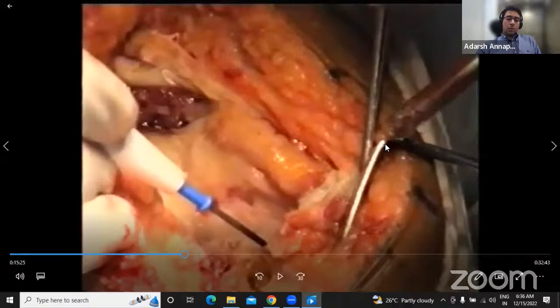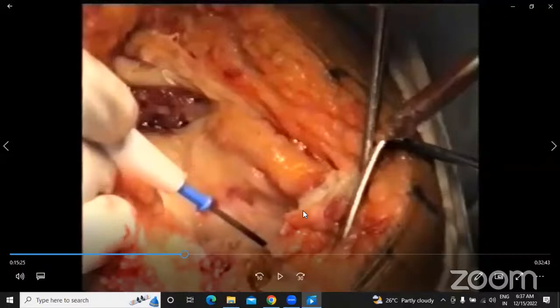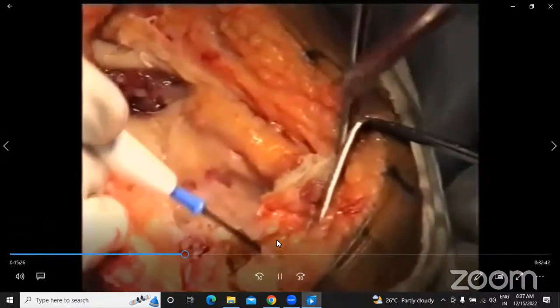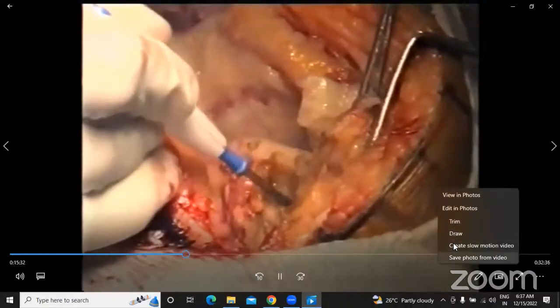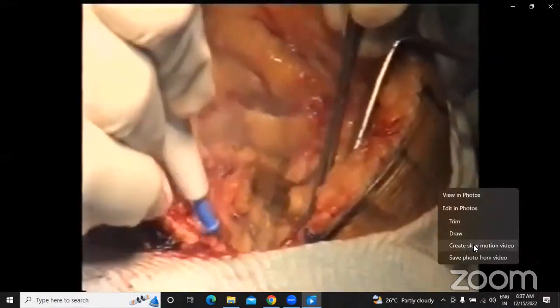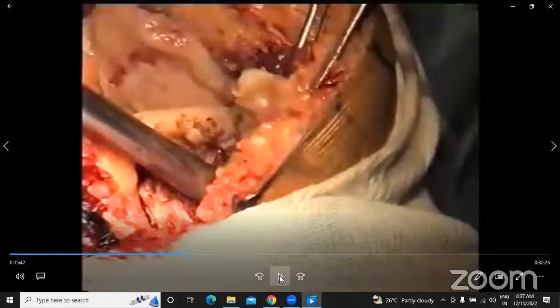Okay. Right. So this was a question that everybody was asking last time. How much do you actually release? If you can see on the lower side, Ratnakar, you can use the pointer. From the center where the tuberosity is, you start going medial. It's important that you stay absolutely on bone so that the cuff of tissue that you're raising is thick enough. Sometimes when you're in haste, as you're releasing, you leave a lot of tissue on bone. Then again, closure is a problem. So stay absolutely on bone and the thickness of your cuff has to be as much as possible. So you don't compromise on that at all.